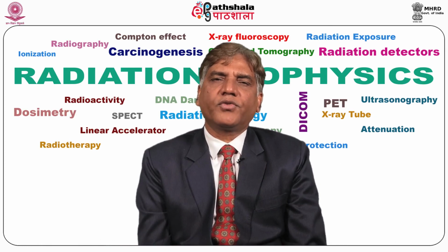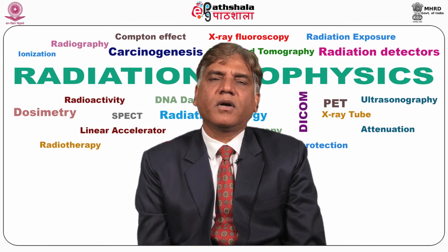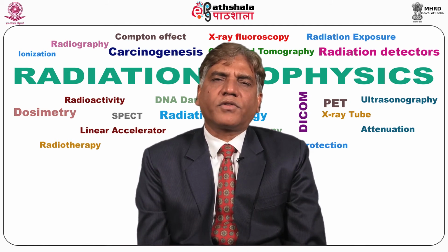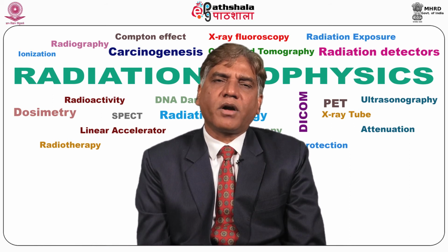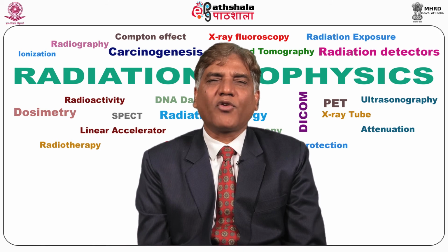At frequency between 2 to 10 megahertz, the Doppler shift falls in the audible range of sound waves, and therefore we can record this Doppler shift, we can hear this Doppler shift. The types of transducer Doppler technique are known as continuous wave Doppler, pulse wave Doppler, duplex scanner, and duplex color flow imaging, and of course power Doppler.